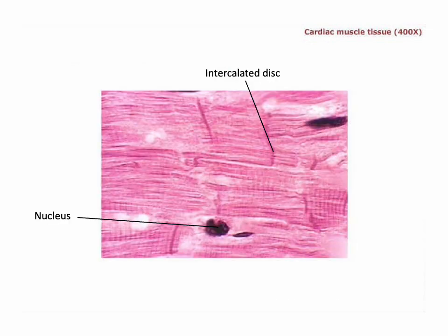Same thing here. We see the muscle cells of the heart. We see a nucleus here, and we see intercalated discs connecting each cell, okay?